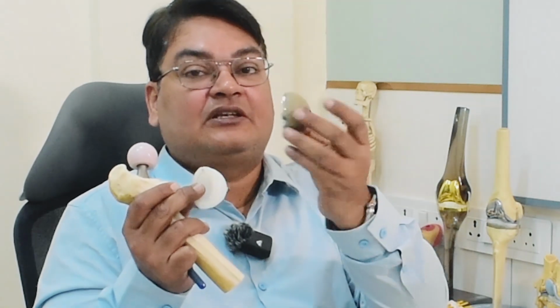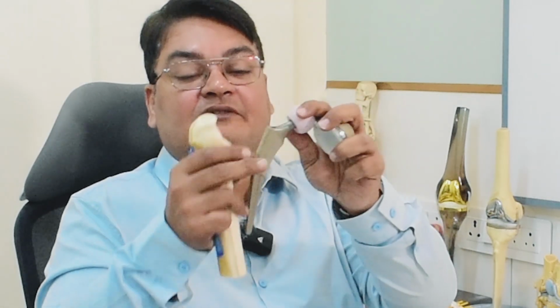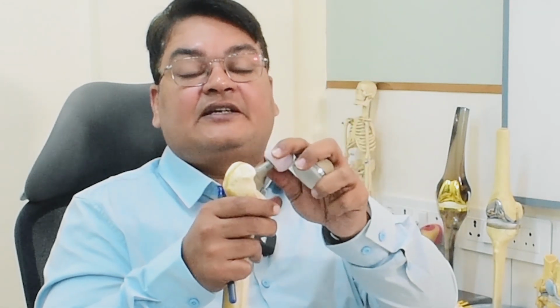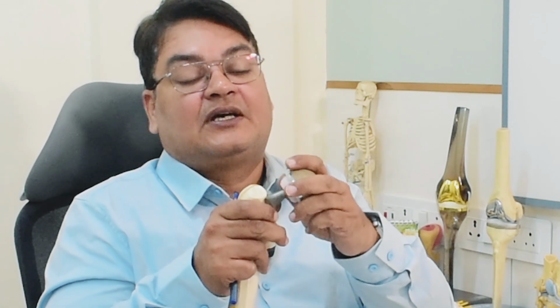So this is the shell in which it goes and fits, and all these things are modular. It comes in various sizes, and everything is tailor-made according to the patient's anatomy. Everything is modular, and this is the head, and everything is put like this. And this is what hip replacement is.